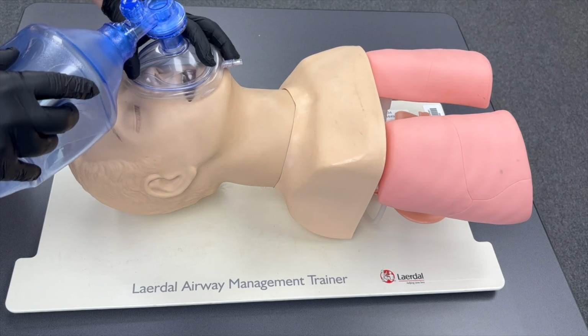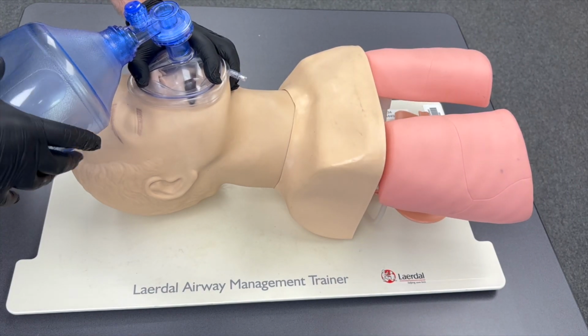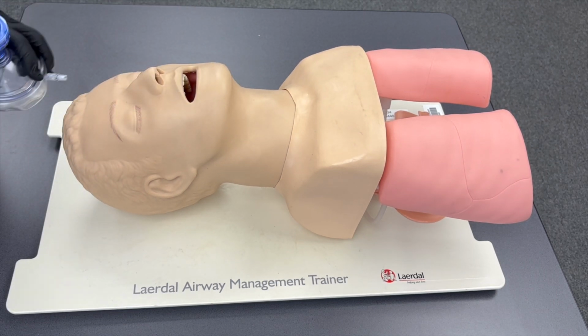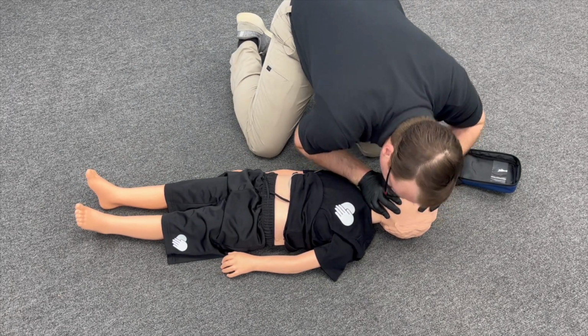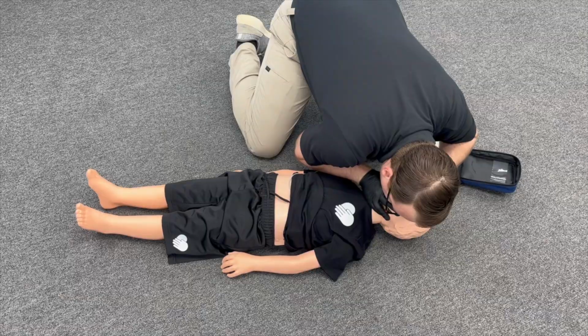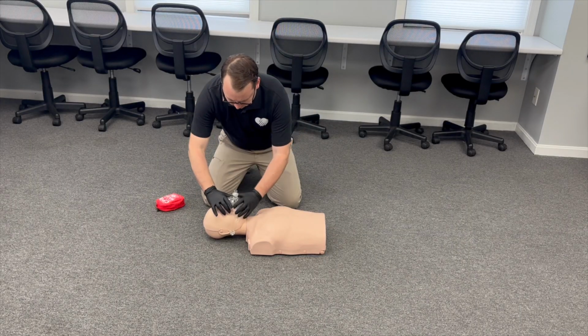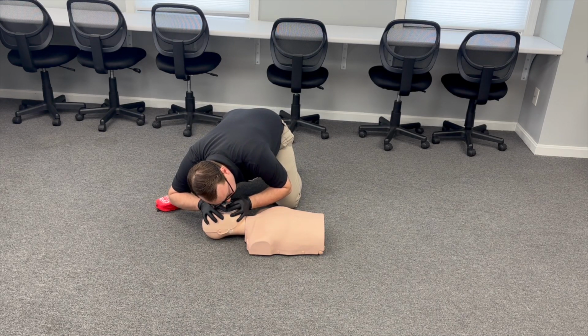Throughout this training, we're going to show you the 3 different ways that you can deliver rescue breaths. The first, and what you're seeing here, is with the use of a bag valve mask, which fully isolates you from the victim. Another method is mouth to mouth, where you directly place your mouth over the victim's mouth and deliver 2 breaths. The third is similar to mouth to mouth, but placing a barrier device between you and the victim's mouth to help isolate from potential vomiting.